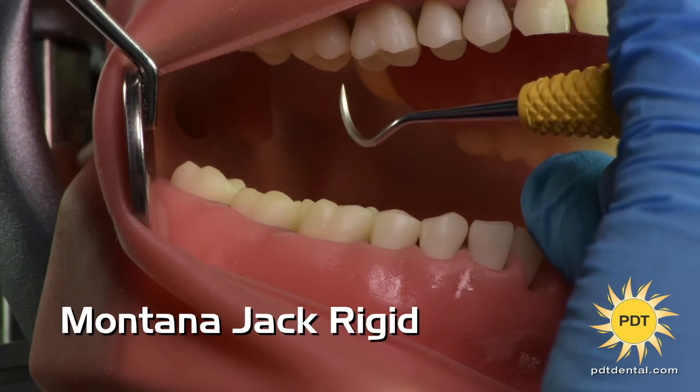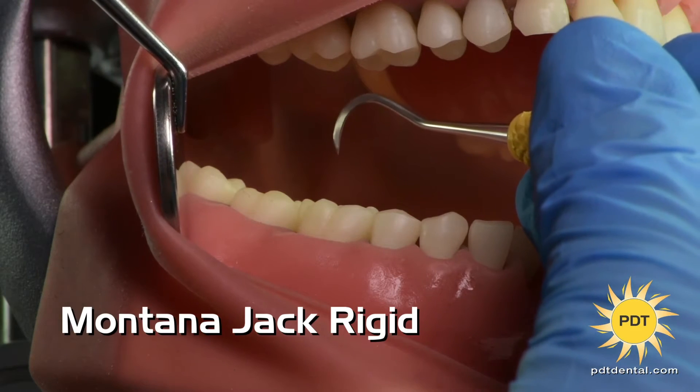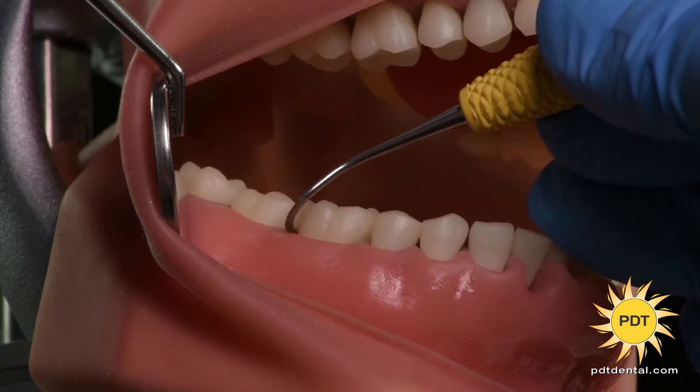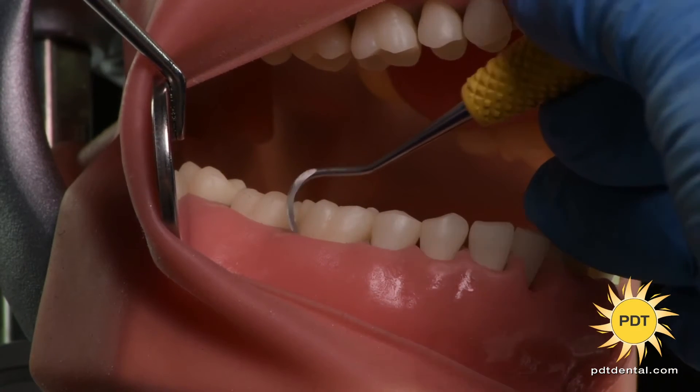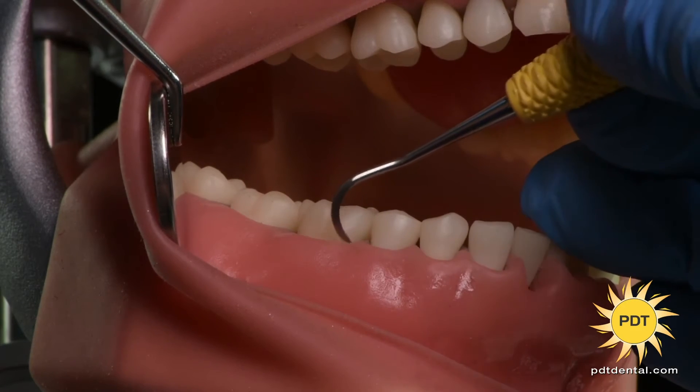Our rigid Montana Jack has a thicker shank and blade, allowing it to withstand more pressure without flexing. This makes it perfect for more tenacious calculus removal and for restorative procedures when removing excess cement or filling material.